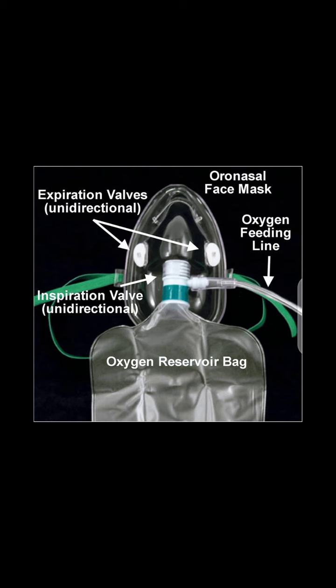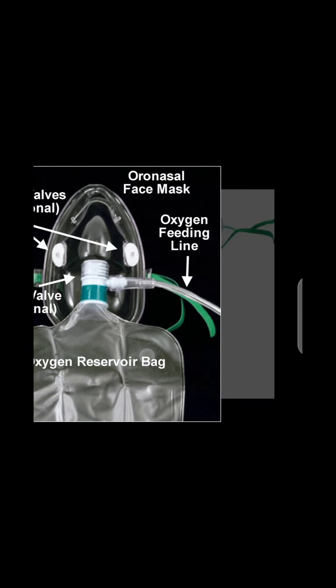That is very important. And we can easily conclude that one of the major risks of using a non-rebreathing face mask is CO2 retention.